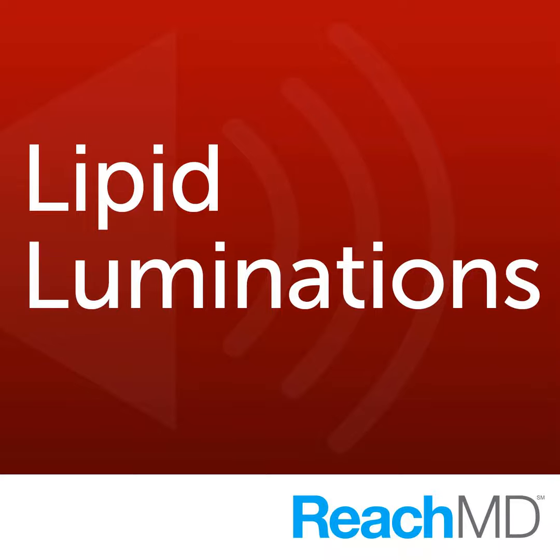But you asked about reproducibility. That's another huge controversy about carotid IMT. A question is always whether serial measurements of carotid IMT should be done. And that leads to the appropriateness criteria, where they stated that repeated measures wasn't one of the appropriate criteria.